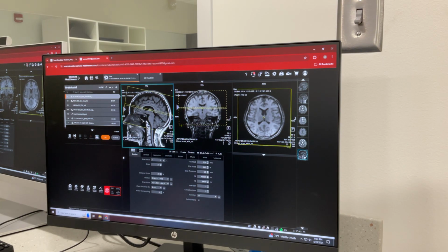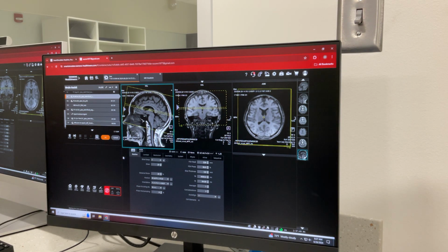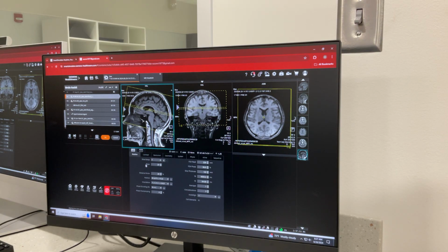Angelica said it too. Okay, so what weighting is this image? T2. What is specific to this? What is the sequence called? FLAIR. It's a FLAIR, so what are we suppressing with this FLAIR? CSF. The CSF. So what do we need to look at? Inversion.